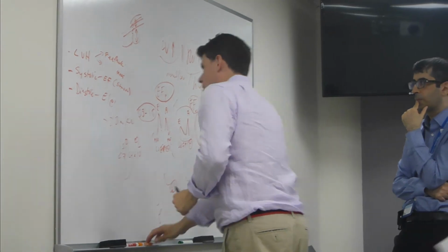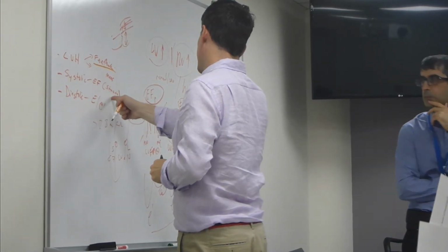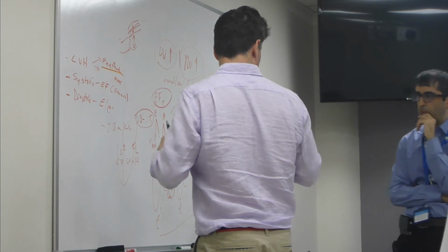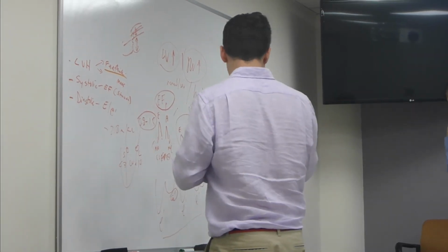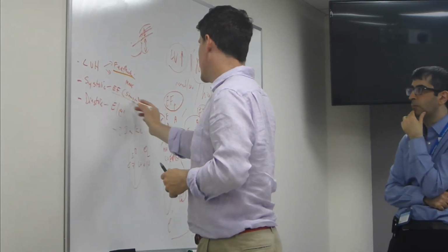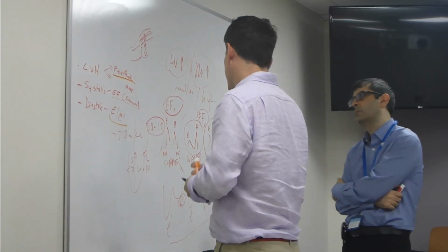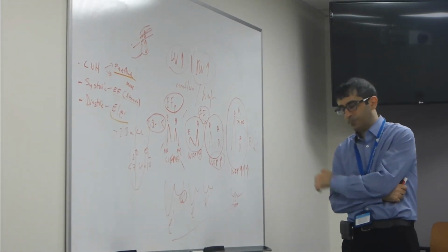So if we're thinking about wall thickness and ejection fraction, I think going over Simpson is helpful. We grossly estimate ejection fraction in these broad categories a lot: normal, abnormal. We don't say 40 versus 45%, but we'll say good versus not. So EF, and then looking at how to get E and how to get E prime. Okay, that's fair. I think that would, for us, be the most high yield things.